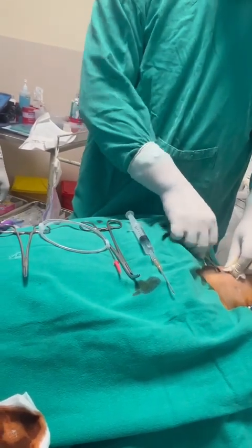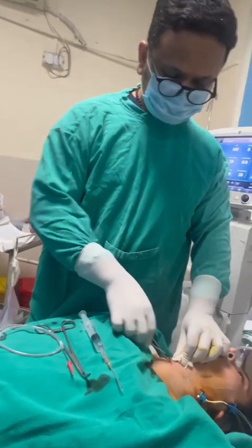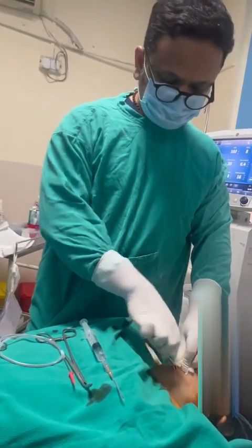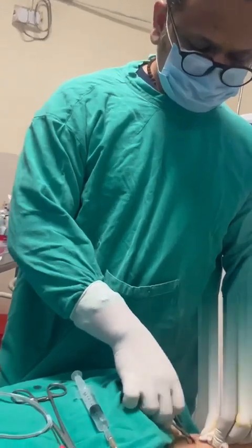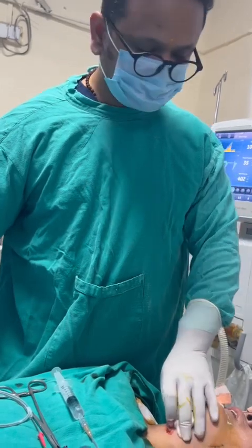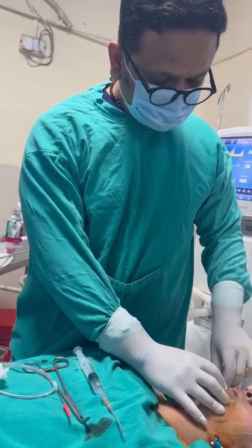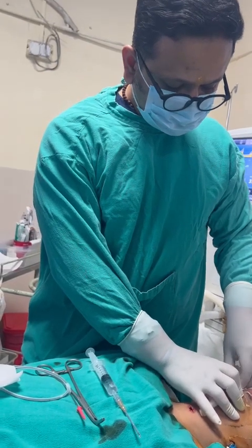What is the heart rate, BP? Heart rate 132, BP 140/82. SpO2 100. BP is 144/85. Very good. So I will withdraw the tube slightly. Just keep the cuff like this.